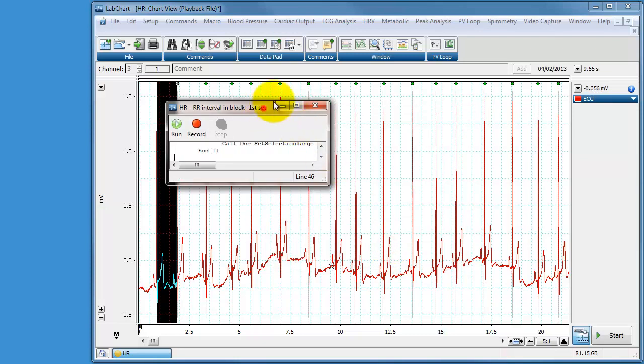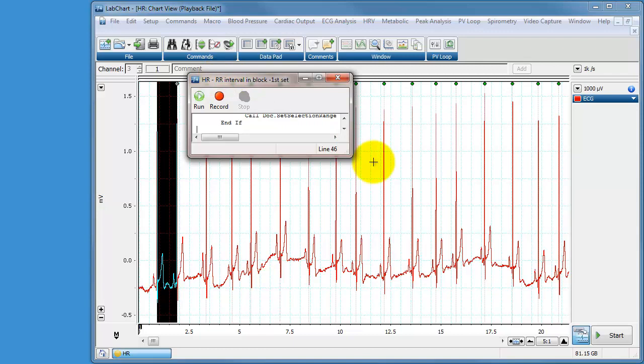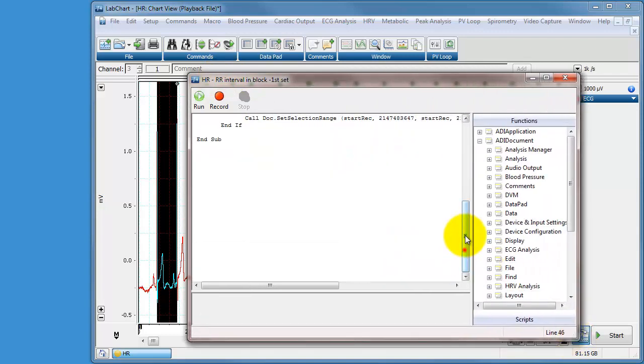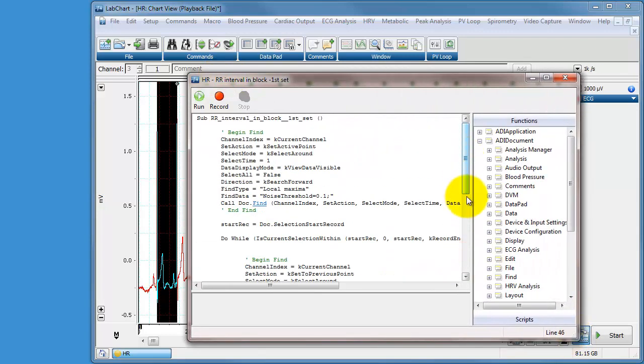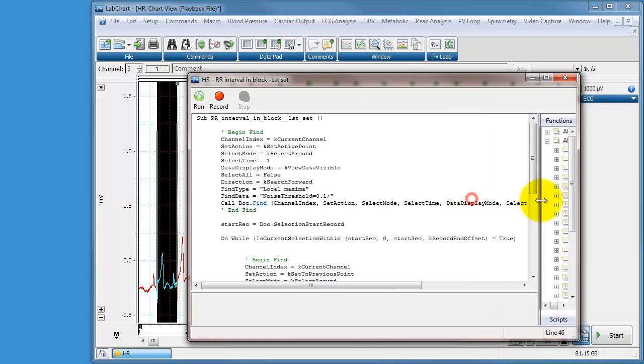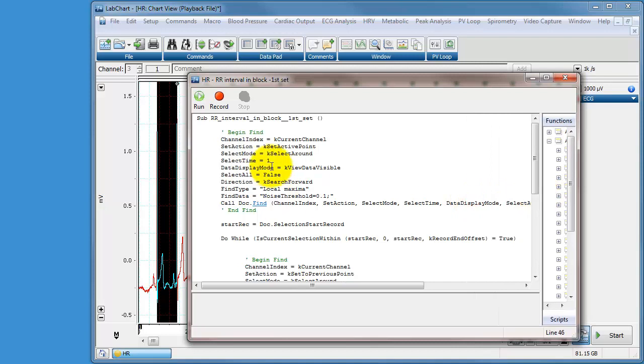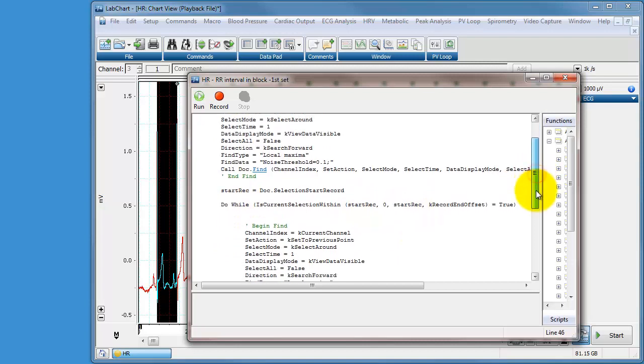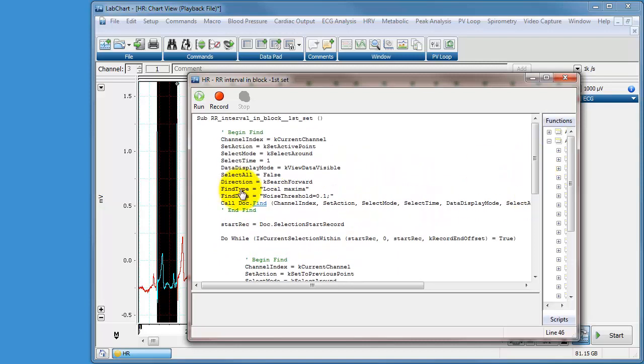It'll load up this little window here which tells us what the language is for our macro just programmed. And it's actually worth looking through this and just seeing what we've done. So what we've done is we've started off by doing a find, looking for a local maxima with a threshold of 10%. We've then found the data and we have added those to the data pad. And then we've gone, sorry we've not added those to the data pad, we've found the data.